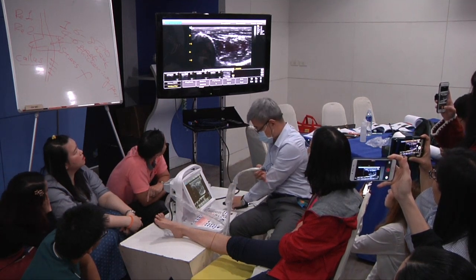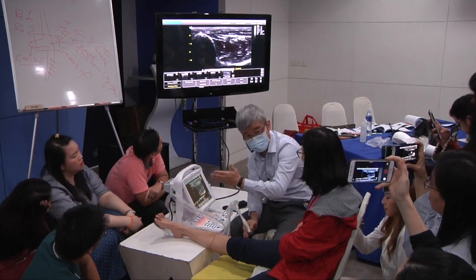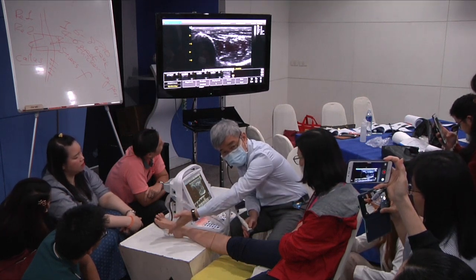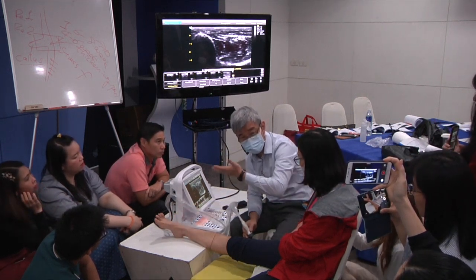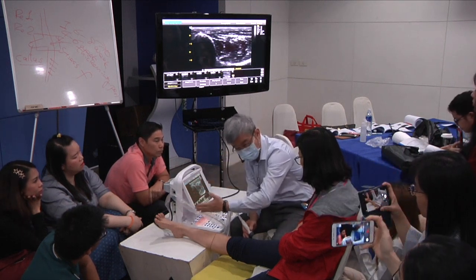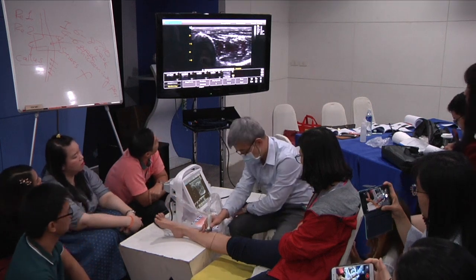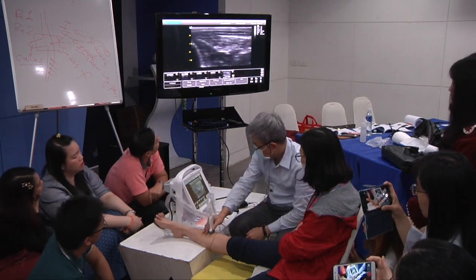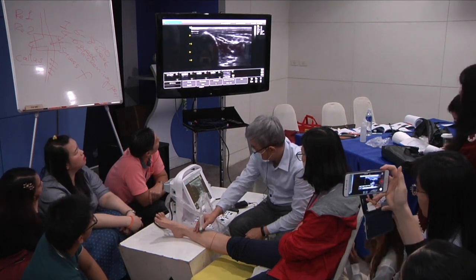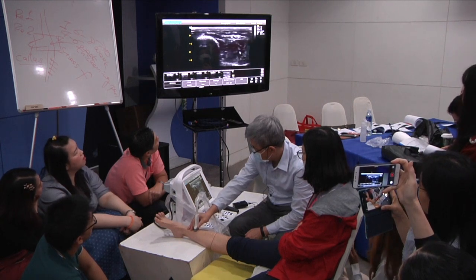Okay. Then, when you get close to the anterior ankle, the tibialis anterior will cross over the tibia bone. Not like extensor hallucis longus. Extensor hallucis longus stays, goes to the big toe. Okay, good. Cross tibia.